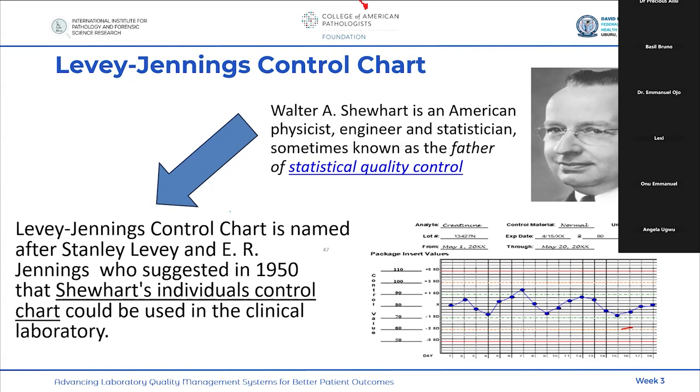So for you to pass that particular analyte, you must be within that acceptable range that has been defined by the PT provider. In most cases, it is plus or minus 2 SD. But some do allow to say that if it is not outside plus or minus 3 SD, it will be taken as a warning, so it is acceptable if it is that. So they are the ones that will decide that. So it's often a range, not a fixed percentage. I think that has answered your question. Please confirm to me that that is okay.